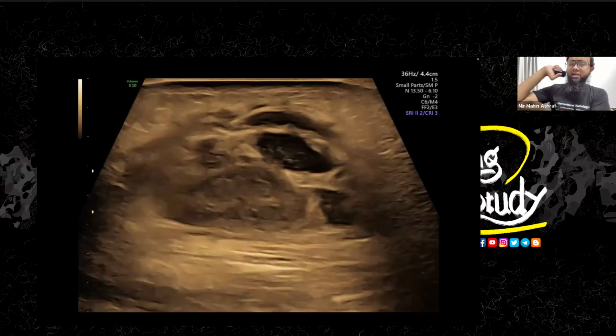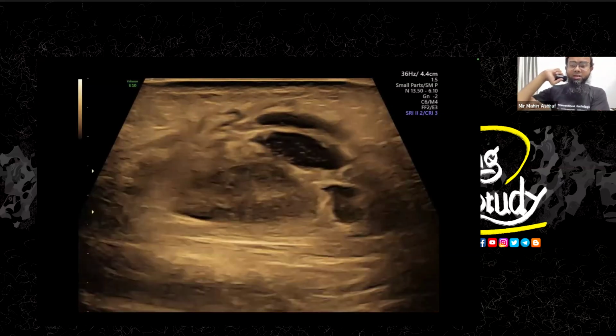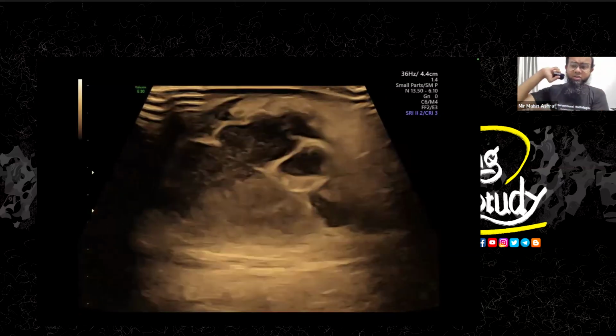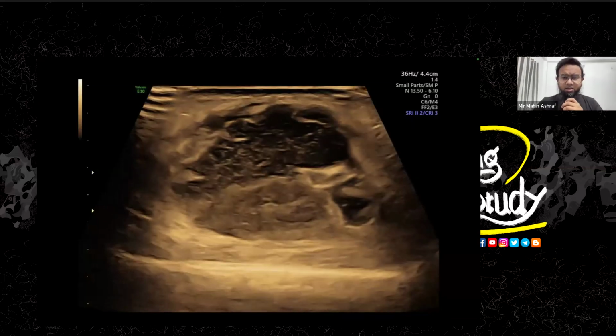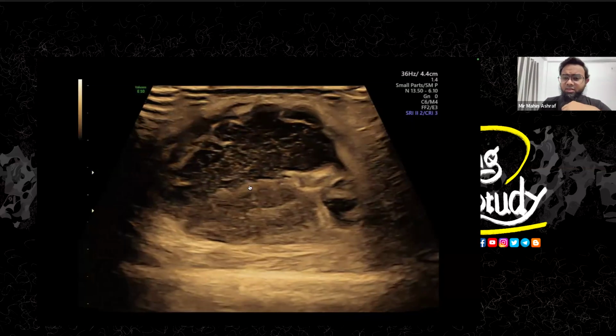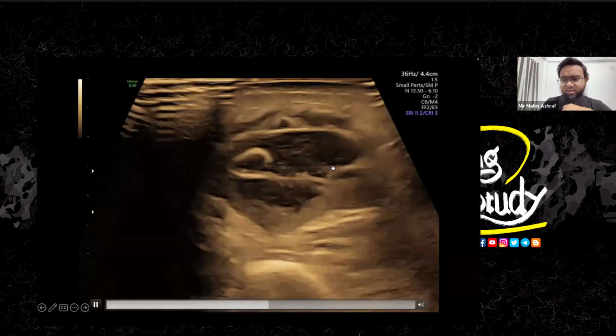This is a very common area for the supratrochlear lymph node, and it can get inflamed. So lymphadenitis or abscess formation is very common at this part. So this is nothing but the lymph node. It is enlarged and surrounding abscess is seen here. This is a hazy content with fat plane irregularity and thickening.